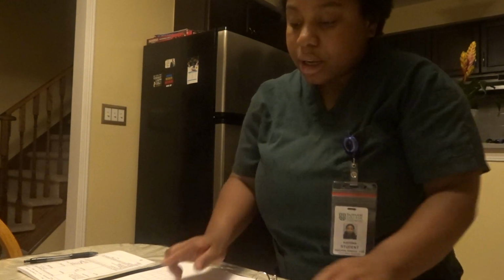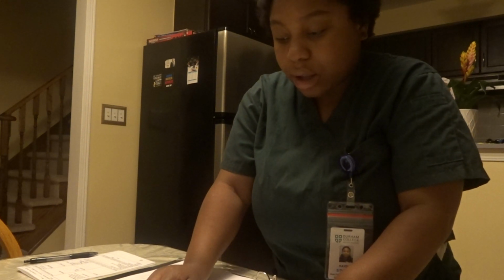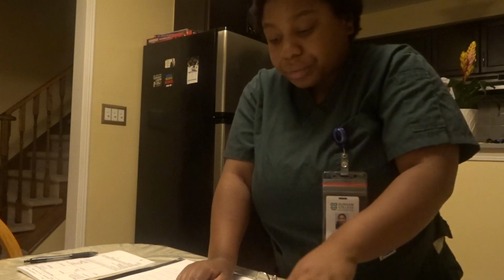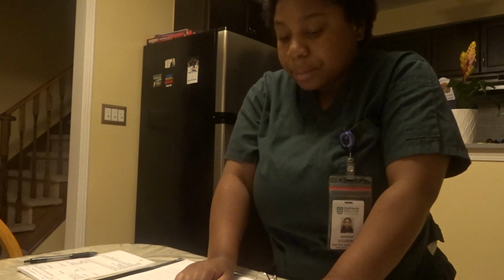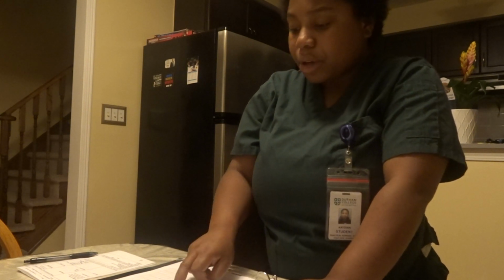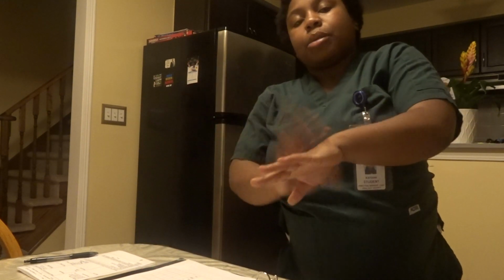So my first check with the medication to the MAR is Sid Garland. Sid Garland is the patient. The medication I'll be administering is cefazolin. Dose is 500 milligrams, and 50 milliliters of normal saline. The route is IV. Frequency is every 8 hours. I'll be administering this medication at 6 a.m. in the site of the patient's left hand.